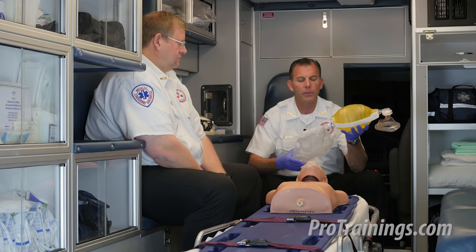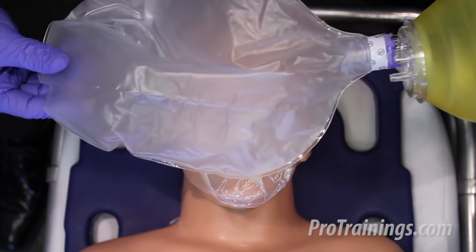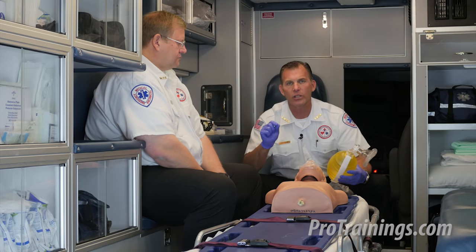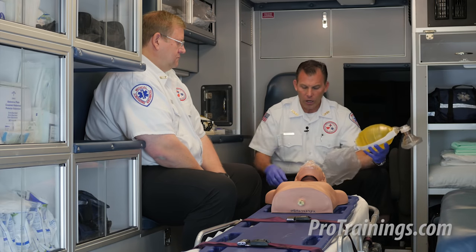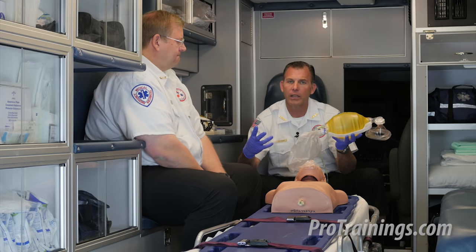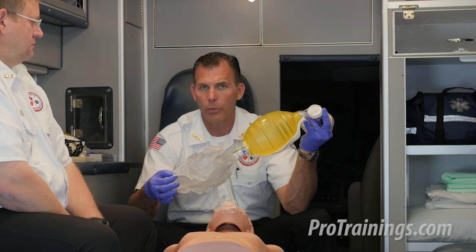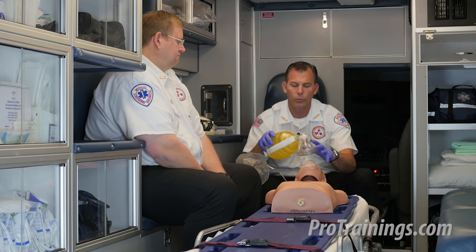Moving along — you can see this bag valve has a reservoir attached to it, as many do right out of the bag from the manufacturer. This reservoir allows us to fill it with 100% oxygen so that when we deliver the rescue breath, we're delivering a higher concentration of oxygen into the patient. If we hook up the oxygen tubing to the oxygen inlet and we don't see the reservoir bag inflating at an appropriate rate, a little trick of the trade: put your thumb over the outlet here, which seals the bag system off and only allows the reservoir to fill. The O2 should be on high flow so we fill that up and keep it inflated while delivering rescue breaths.